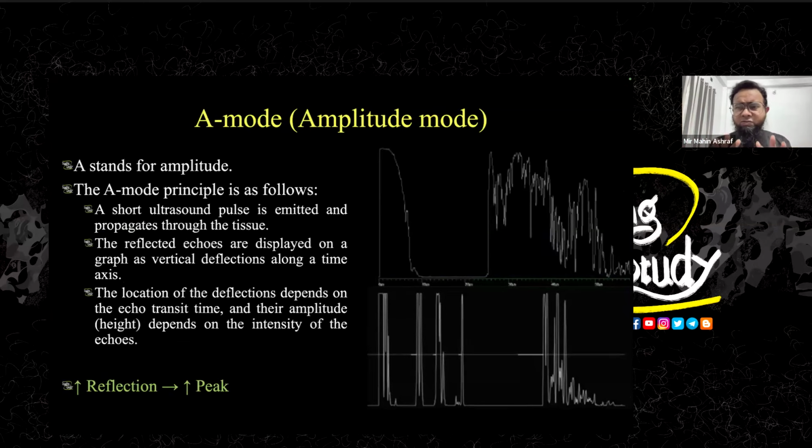The formula is very simple. We put a graph, and the report is on a graph. From the surface, if you get a high reflection, then you make a very big peak, and if you get a low reflection, then you get a small peak. Like with this picture, there is no peak, so there is no reflection here. So possibly this is an anechoic area. And you can see a big peak here, so there is a highly reflective, dense structure there. That doesn't give a good result or makes us a little confused about what is going on there.